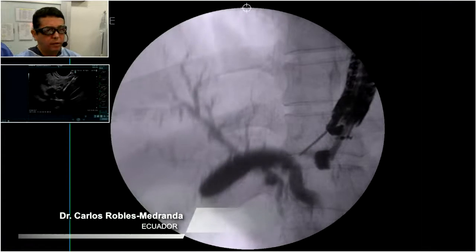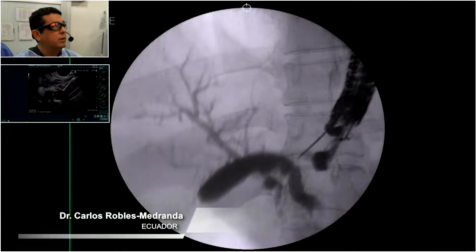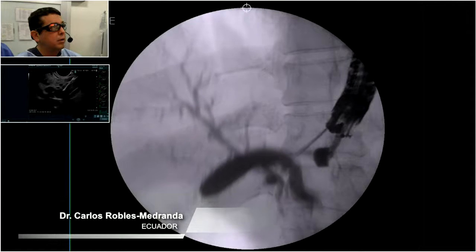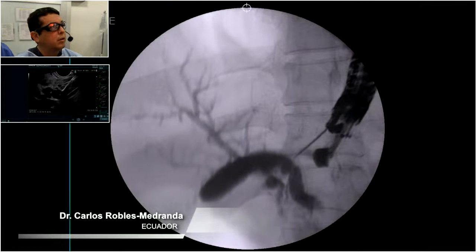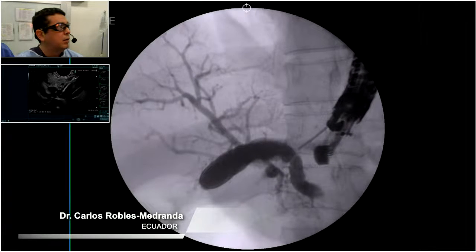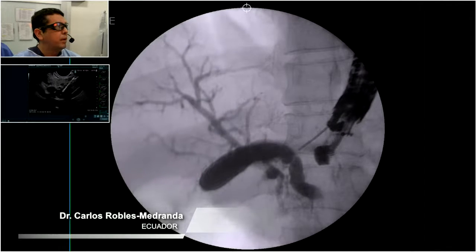Okay, now I need to change. So it goes there, but you see, I don't have any chance here.